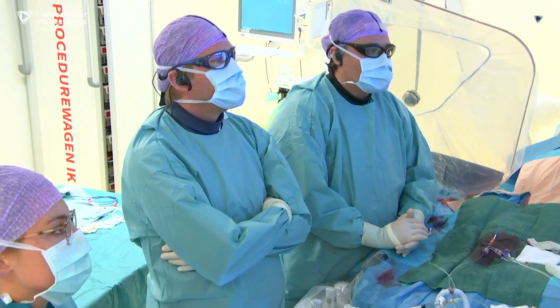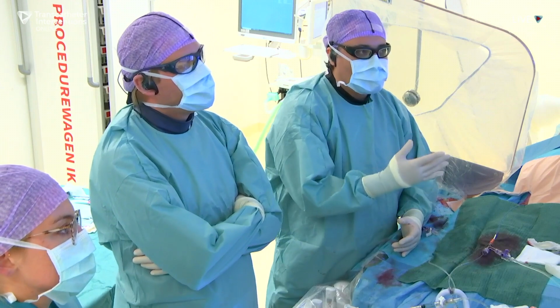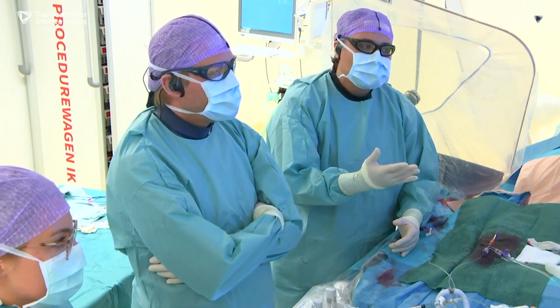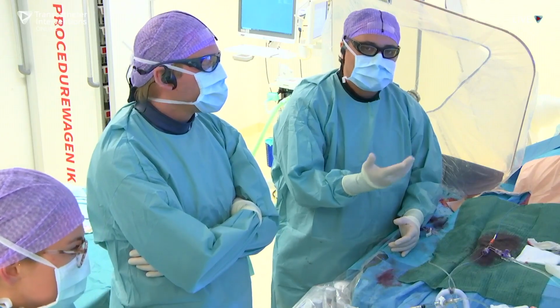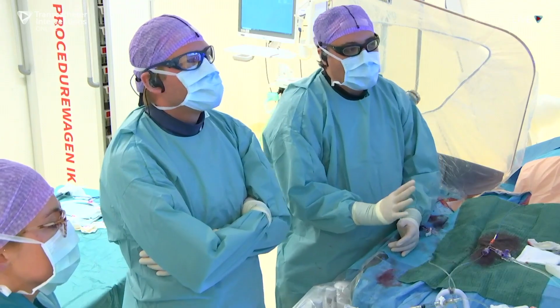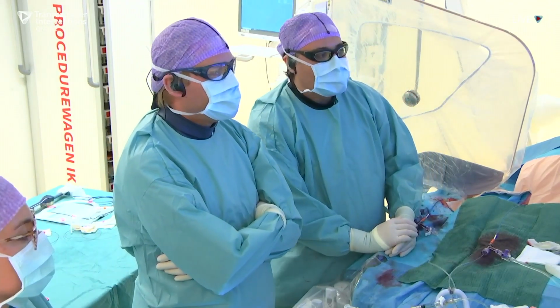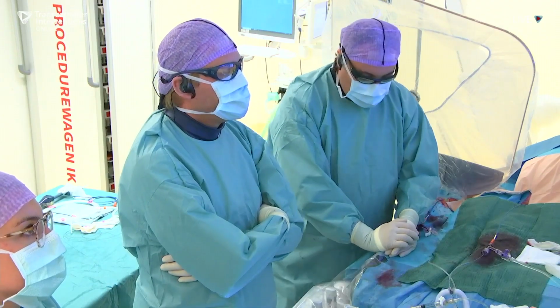And I need to check if we are coming from the epicardial to a side branch. So probably what we saw distally, this small vessel, could be that we are entering in the right from a side branch, not really from the main branch. So I want to double check this, and then we will go for stenting in the proximal mid portion.